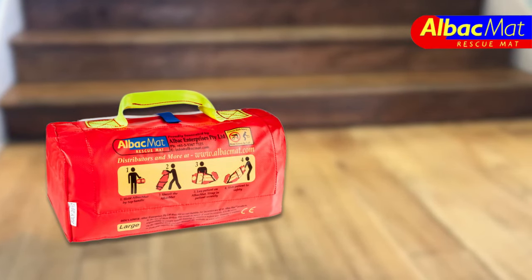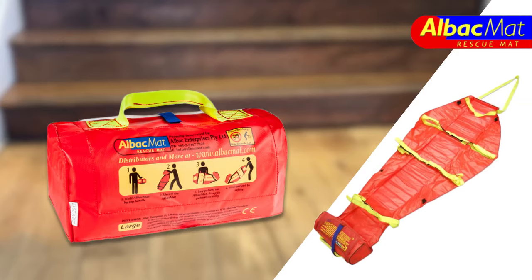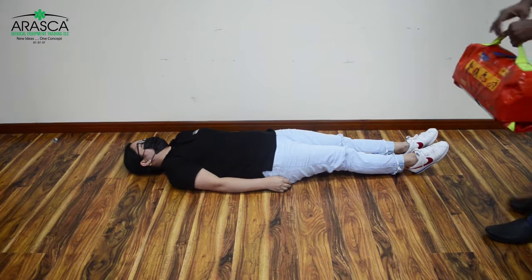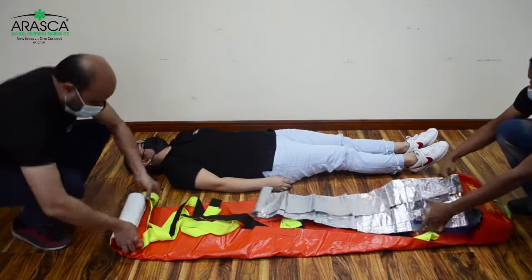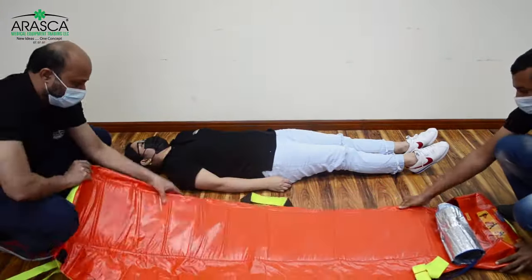The AlbacMat is a portable evacuation mat that enables a quick and safe evacuation of frail or injured individuals from a life-threatening situation. The AlbacMat is designed for a single-person emergency operation in confined spaces. It is light, compact, and extremely handy, making rescue fast, thereby increasing the chance of patient survival.